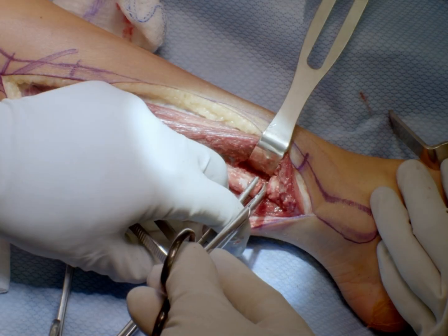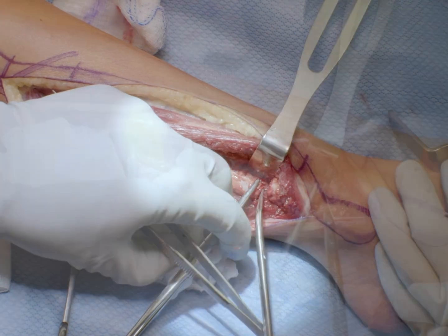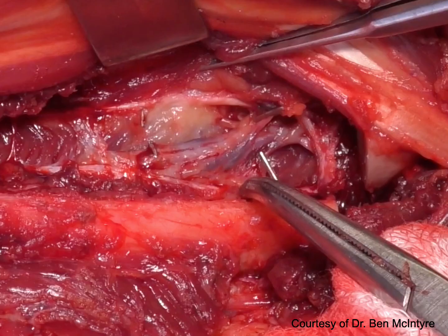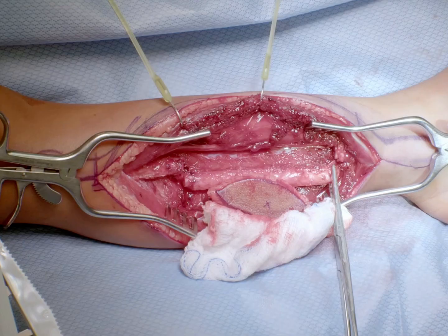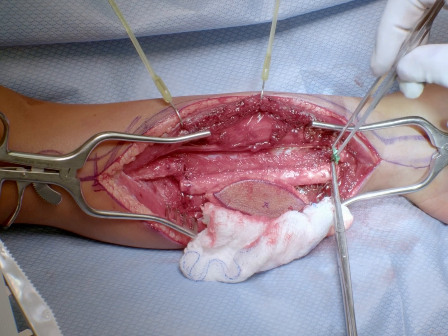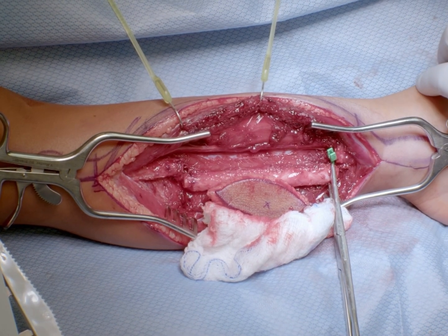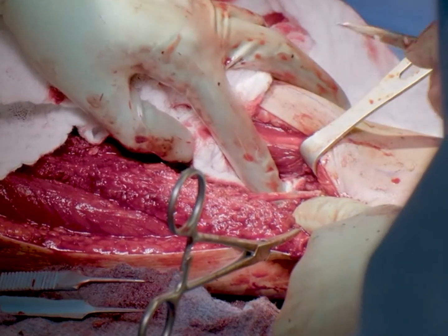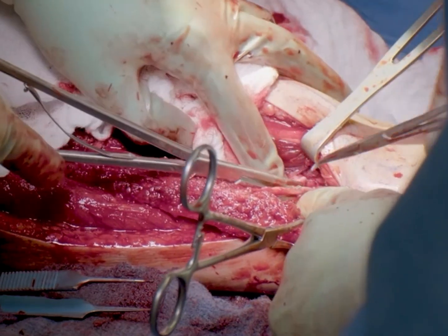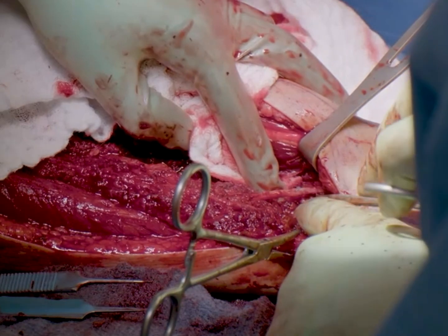Next, the interosseous membrane is divided to identify the peroneal artery distally — this may be small in pediatric patients, but in adults the caliber should be 2 to 3 mm in diameter. To ensure adequate perfusion to the foot, prior to vessel harvest the tourniquet is let down and an Acland clamp is placed on the pedicle to assess flow to the foot. The pedicle is then ligated distally, with the artery and vena comitantes ligated separately. The maximum length is harvested to preserve the ability to perform a reverse flow anastomosis as a bailout if needed.